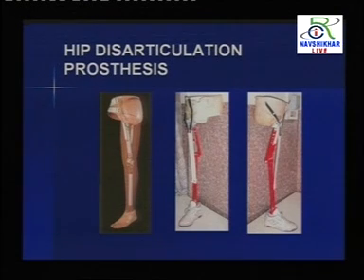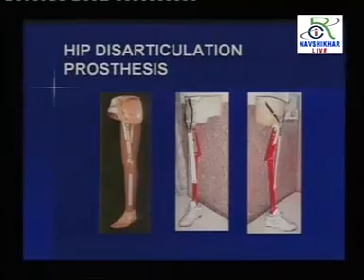वेट में इतना फ़र्क नहीं आएगा क्योंकि उसका और इसका वेट में ज़्यादा फ़र्क नहीं आया था, बराबर ही वेट आ रहा था. The fabrication system is the same, the weight bearing area is the same, keeping the angle and everything, that alignment is the same. Only thing, we reduce the cost by using a local material, using the local mild steel and the tubing and aluminum tube itself. With this, we could get very good results of the prosthesis, which can be provided to the persons who are disabled.